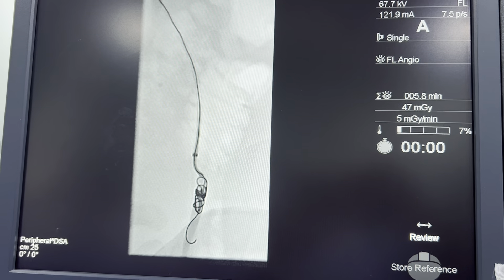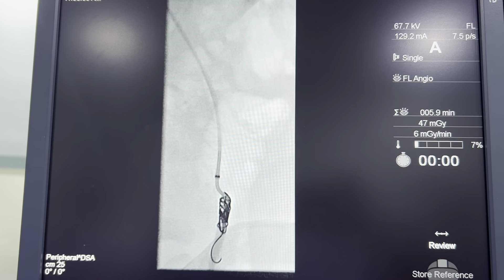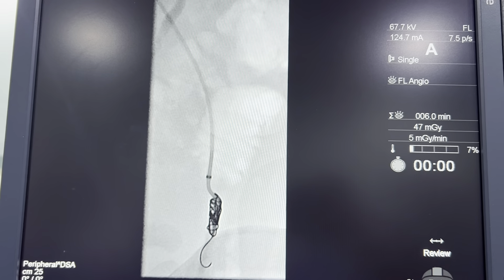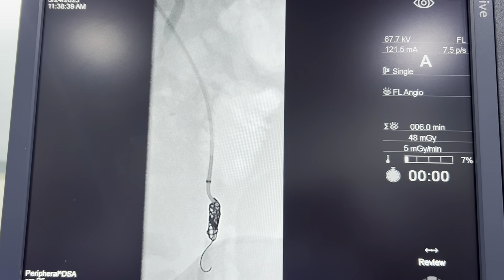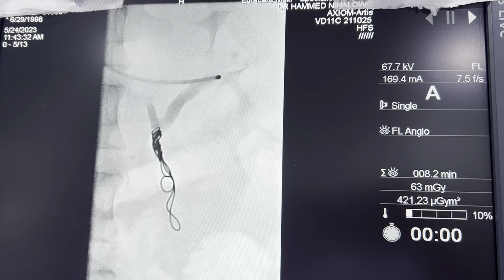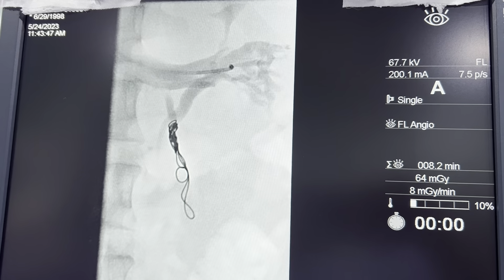We're placing the second set of coils within the gonadal vein. We put the first one already. Now we're going to do an injection just to ensure where the renal vein is, to ensure we don't have any coils in the renal vein when we're done. So we're done on the left side here — you can see we've basically embolized that left gonadal vein.